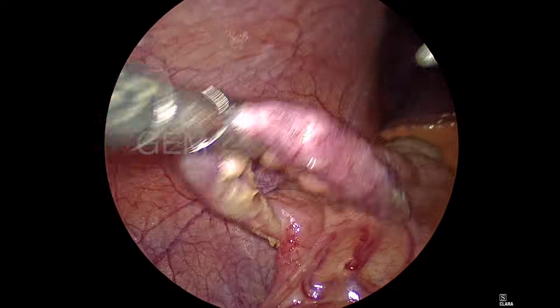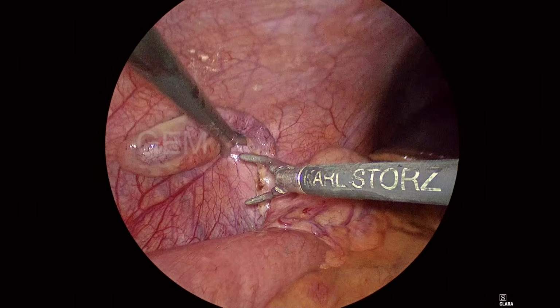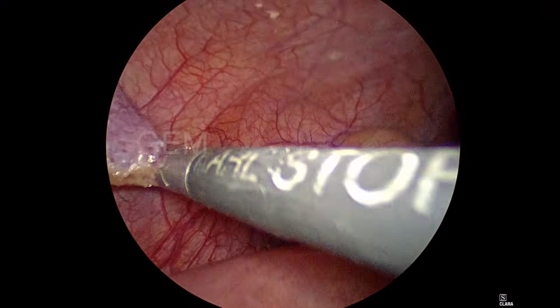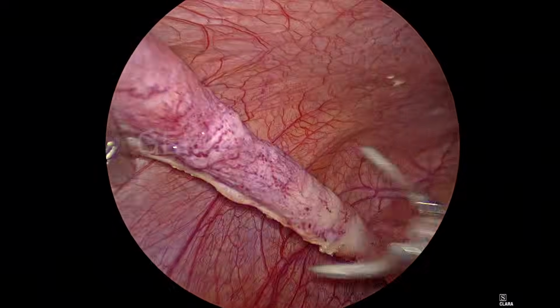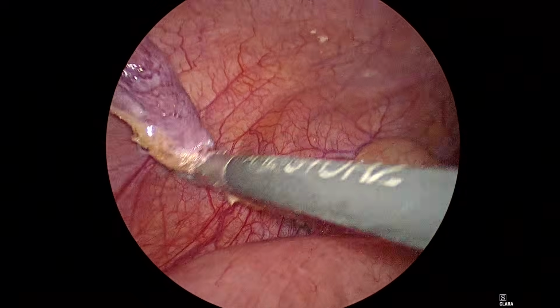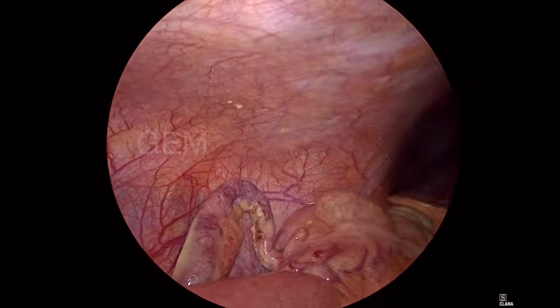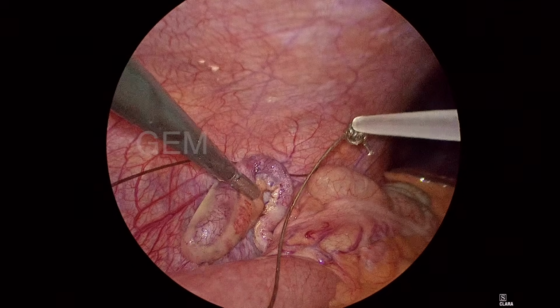So as usual, hold the tissue covering the appendix, not the entire lumen. I am holding the tissue so that the lumen of appendix is free, and I am milking it out. Don't hold the full thickness of appendix and then milk it out. Our aim is to move the content of the appendix towards the tip, so that we can apply the base loop to the base.